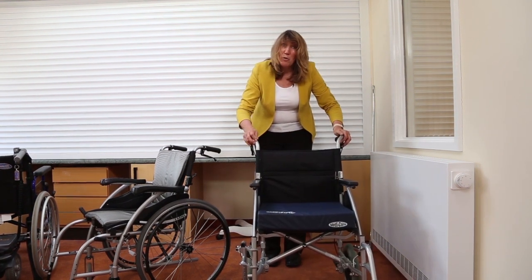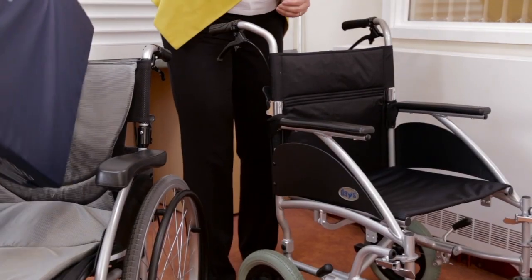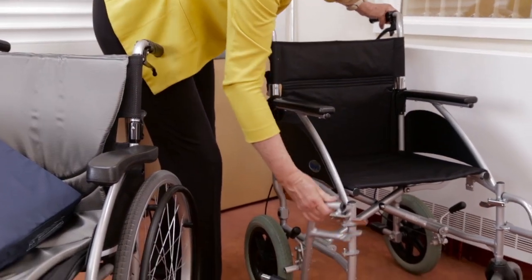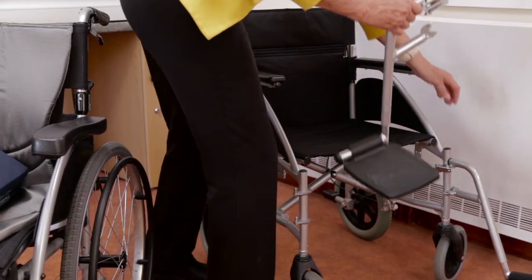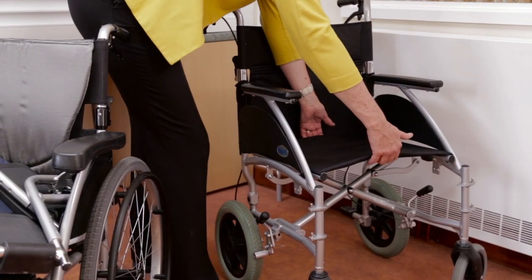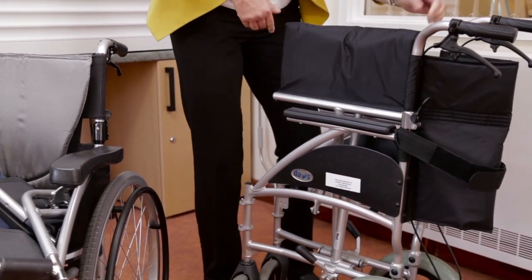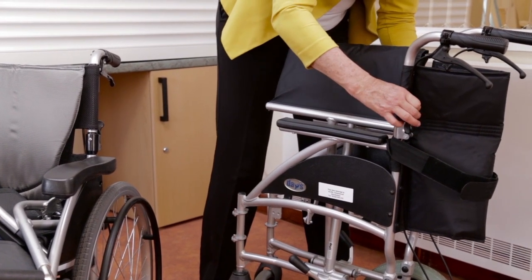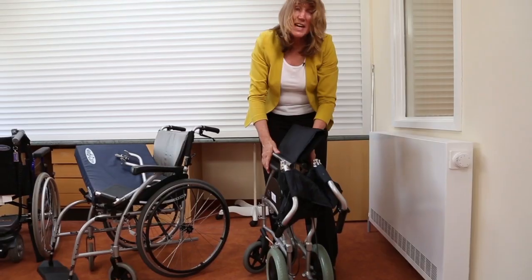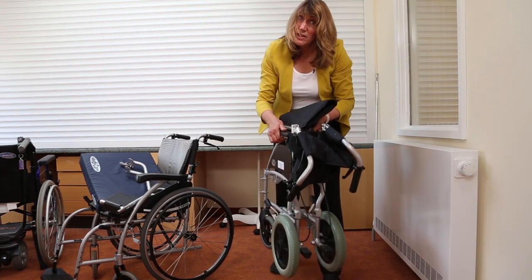The chairs are all very foldable. Most of them fold in the same way. If you're going to put it in the car, I would always recommend you take the footrests off so that they don't swing round and either catch you or your car. You can then just pull up on the middle of the seat, that folds the chair, and then there's usually 2 little clips on the back of the chair where you can squeeze and fold down. So now you've got a much more compact chair to enable you to lift it in and out the car.